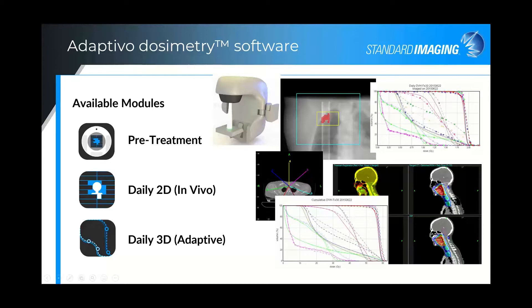A little background about the Adaptivo module: it performs a complete 3D comparison, beginning with a daily cone beam CT which is registered to the planning CT, creating a merged CT image. The planning CT fills in areas where the CBCT may not cover. Deformable registration is used to generate contours on this daily CT. Dose is calculated on the daily CT and accumulated on the planning CT. The entire process is automated and requires little intervention by the user.